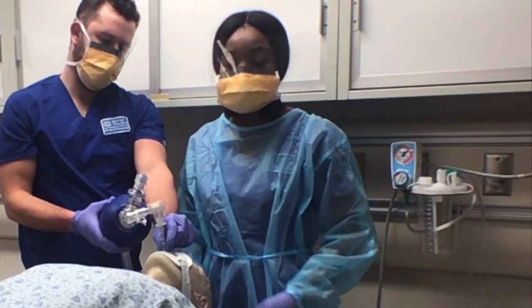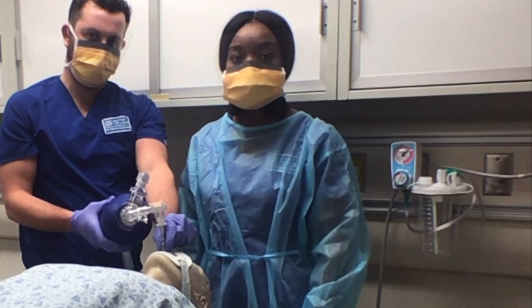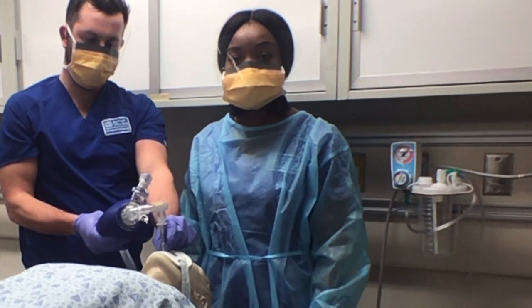The ET tube is now secured, and now we are ready to initiate mechanical ventilation.